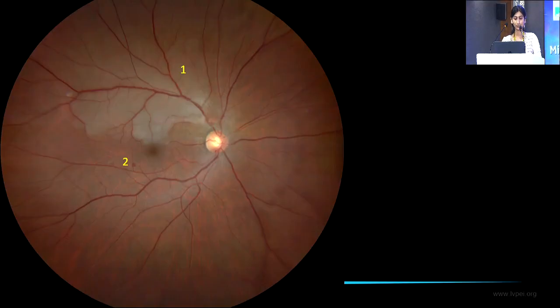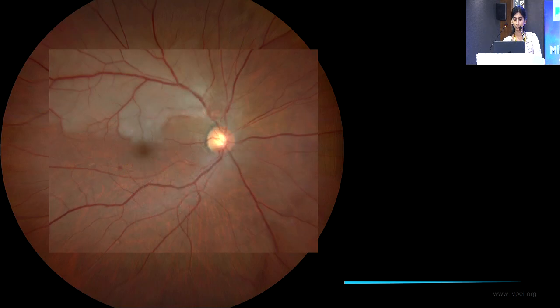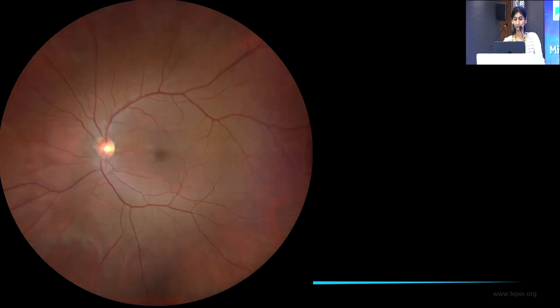On posterior segment evaluation in the right eye, as we can appreciate, the media is clear. The disc margins are well defined with a cup disc ratio of 0.3:1, and there is retinal whitening along the superior vascular arcade, and also there is a dot hemorrhage inferotemporal to the fovea. And if you look closely, there is an orangish lesion superior to the optic disc at the level of the retinal arteriole, which is suggestive of a retinal artery macroaneurysm. The left eye posterior segment examination was unremarkable.